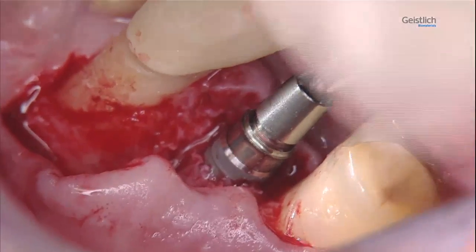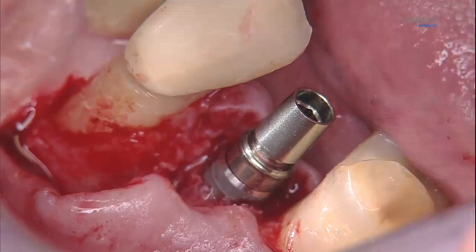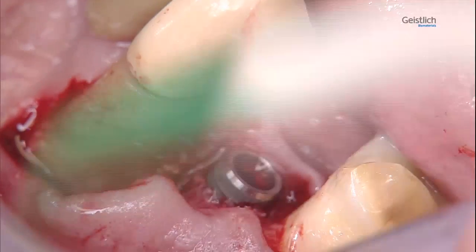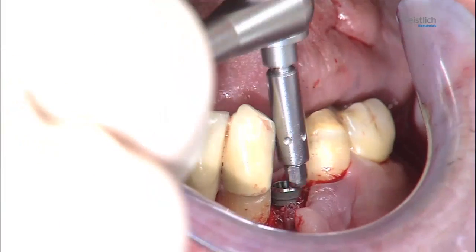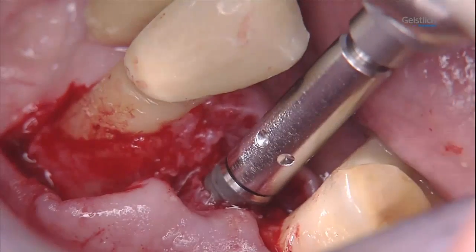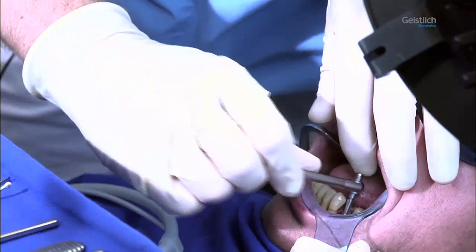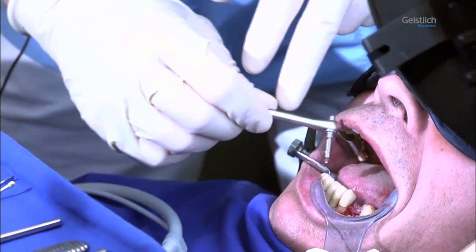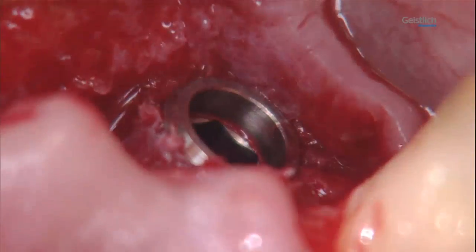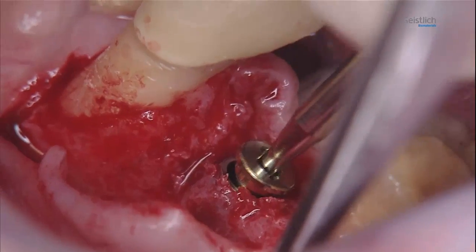We now detach the insertion tool from the implant. Final primary stability of the implant is achieved manually using a ratchet. The implant shoulder is now located just above the bone level. The implant is sealed with a cover screw.